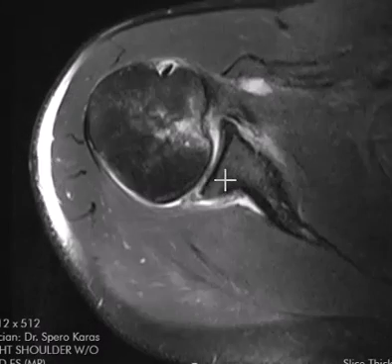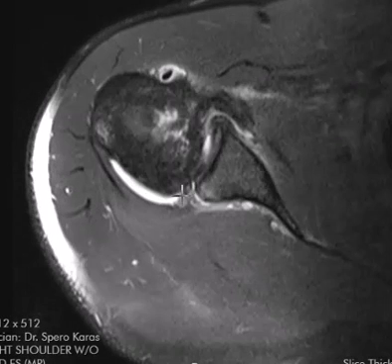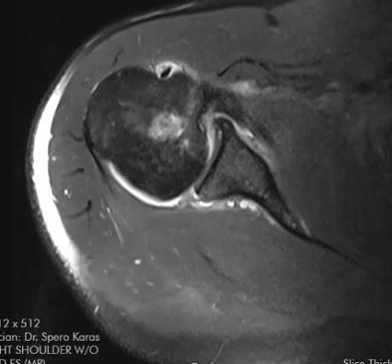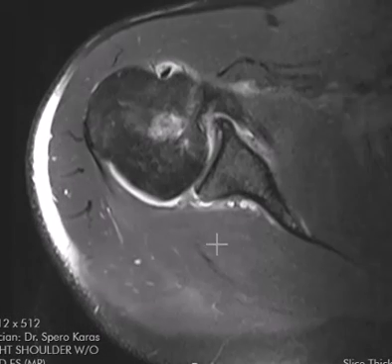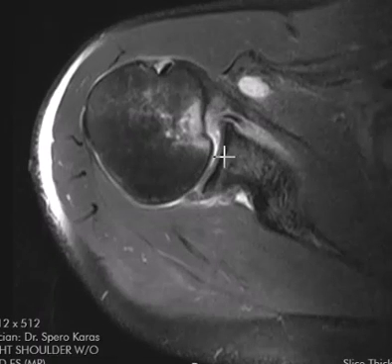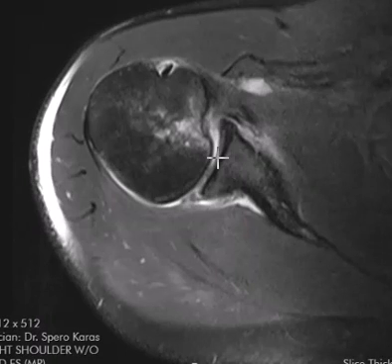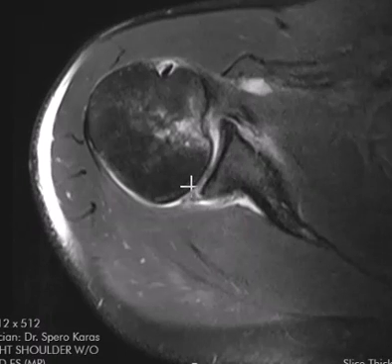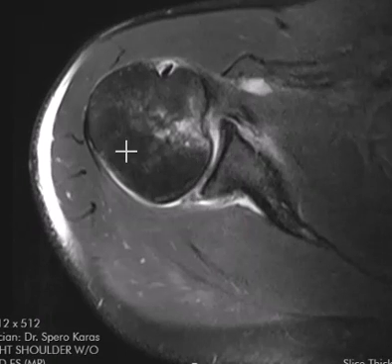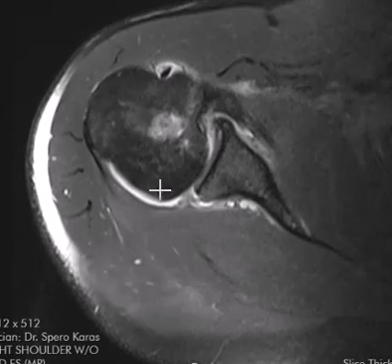With lots of findings, in the end we call this: evidence of a posterior shoulder dislocation with a prominent reverse Hill-Sachs impaction injury and a prominent fibro-osseous reverse Bankart lesion. One last thing to look for in these patients: is the humerus sitting in normal position in the glenoid? And it's not — you can see the epicenter of the glenoid is right here, and the epicenter of the humerus is over here, showing lots of posterior subluxation. They have posterior joint instability, with the humeral head drifting backwards.